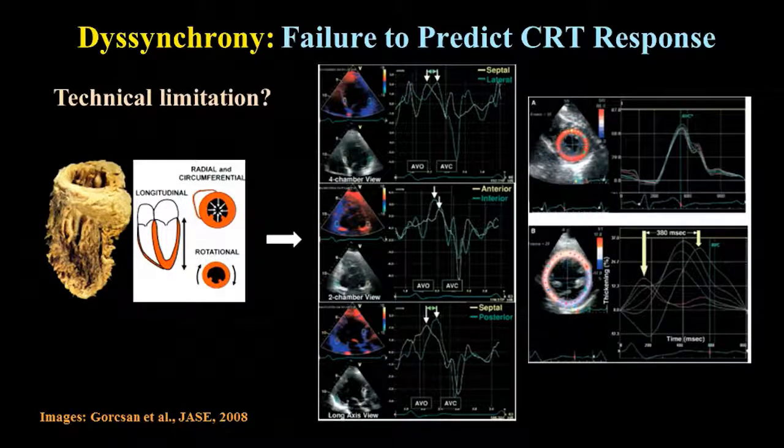Now this is tougher and less reproducible than longitudinal strain assessment. So all you are assessing is the change in fiber length in one direction, whereas you know that myocardium contracts not only longitudinally and radially, but also rotationally. So we are missing so much contractility in the myocardium, because we assess it in 2 dimensions instead of a 3-dimensional assessment.